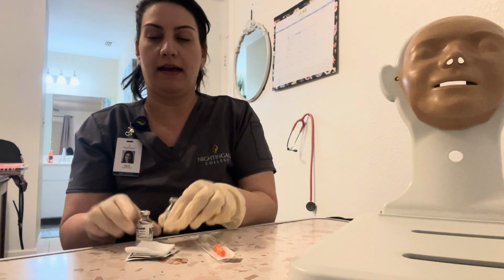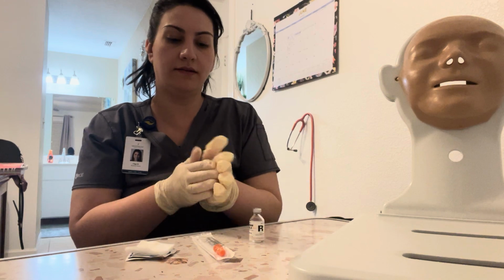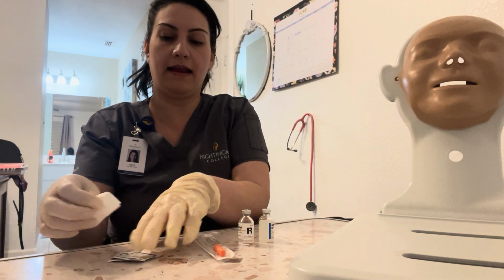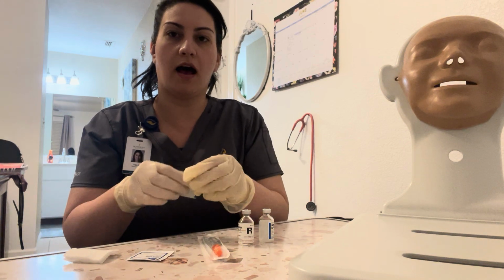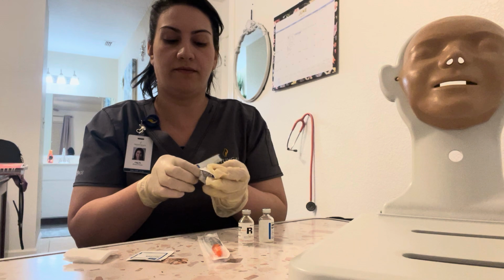I want to go ahead and roll my medication vials, and I will go ahead and clean the tops of the medication vials.